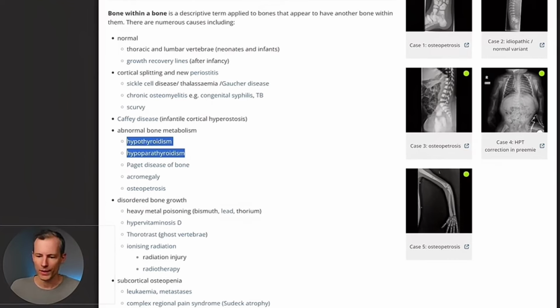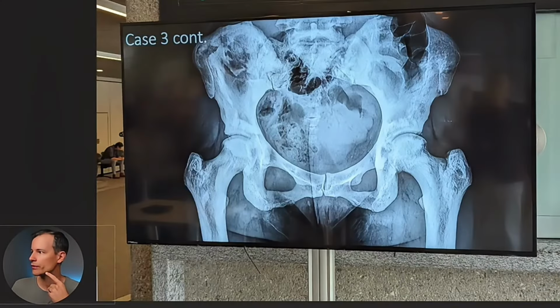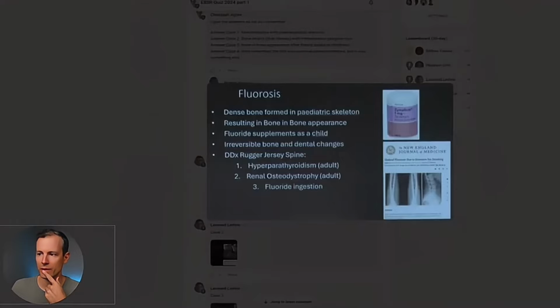I didn't really know what it was, to be honest, but what I wrote down, and I think that's the funny bit, you can see it here, I'm not sure if I can show you this on the camera: metabolic disorder, check the labs, or check the blood for whatever is going on, because I thought we didn't have the complete information at that time. I'm not sure if I got the point, to be honest, but let's go to the solution of the case.